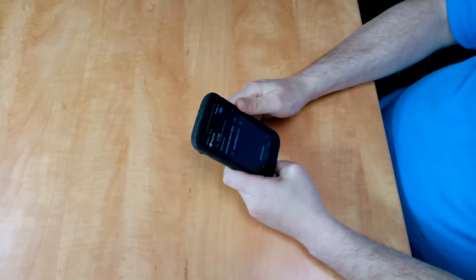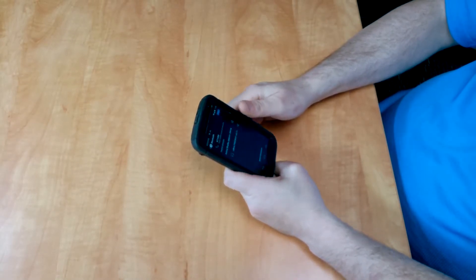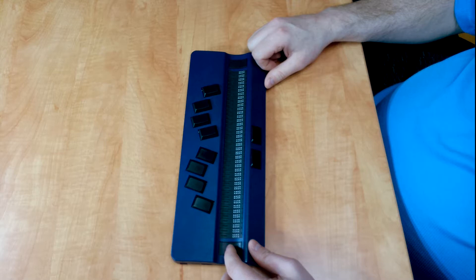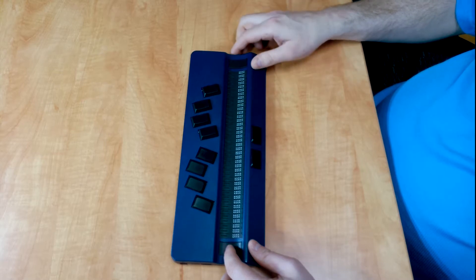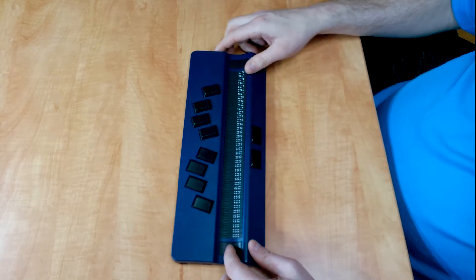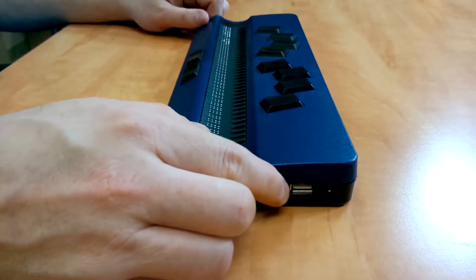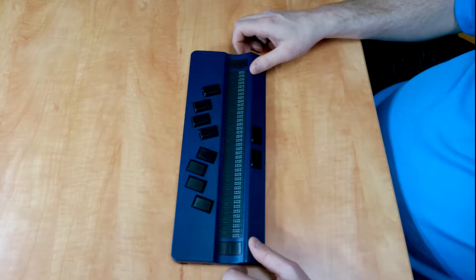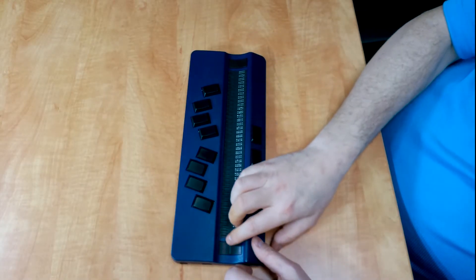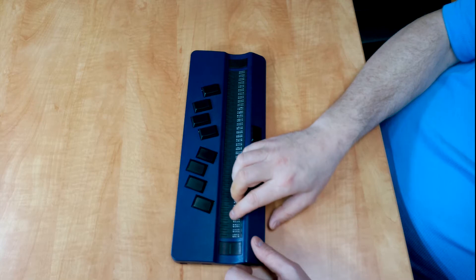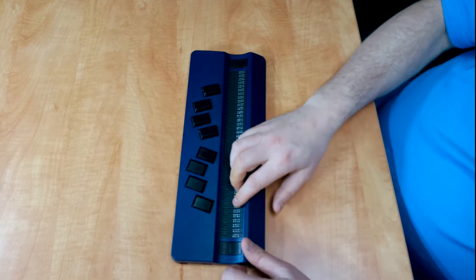So now that we have the Bluetooth turned on, we're going to grab the HandyTech Active Braille display. What we need to do is turn Bluetooth on on our HandyTech Braille display. So I'm going to power the unit up, put the switch on the right, and the unit beeps to tell us that it's on and the Braille display shows the words HandyTech.